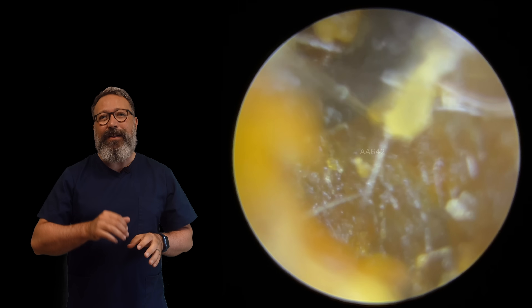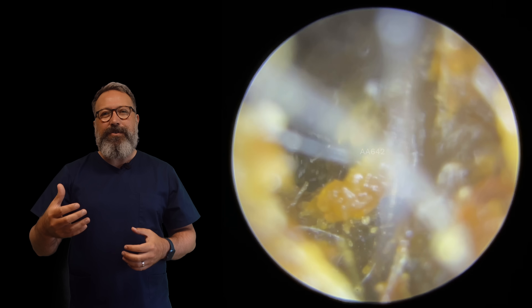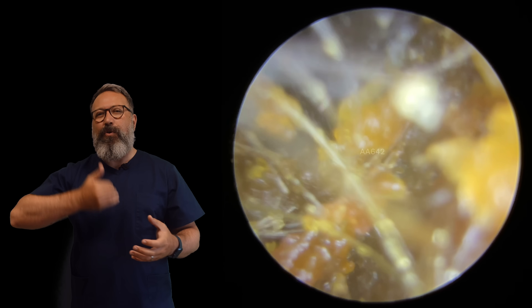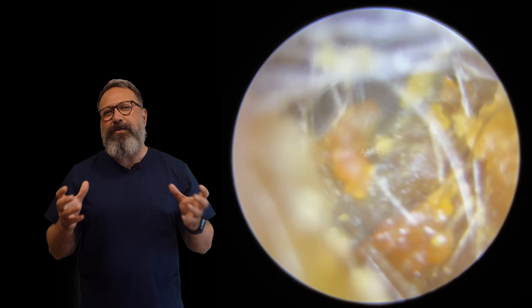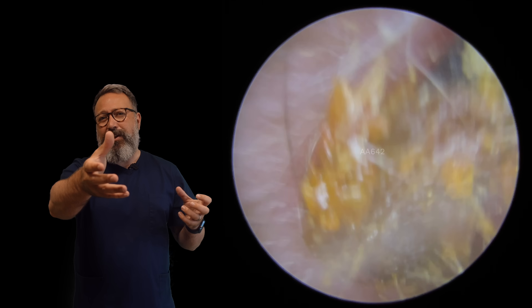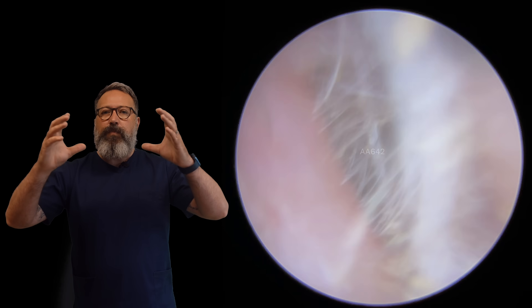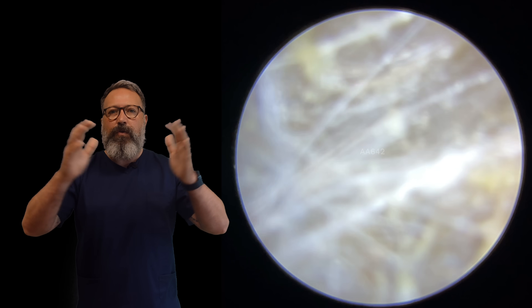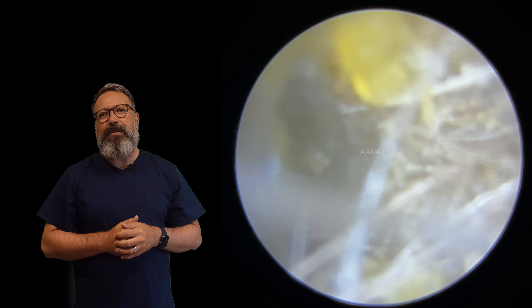As a consequence of using the Jobson horn, we're taking a central portion of the wax away constantly, and that's going to allow this very thin outer edge of wax — which is stuck really firmly to the canal walls — to be freed up. You can see the chunks are starting to get a little bit bigger now. What we're going to have to do in a minute is start folding these sides down — just by pushing — you can see me pushing them across with the Jobson horn.